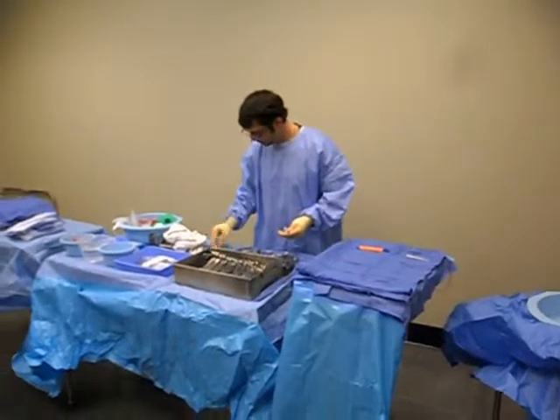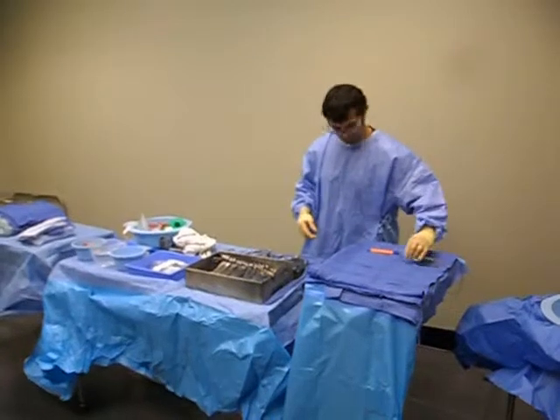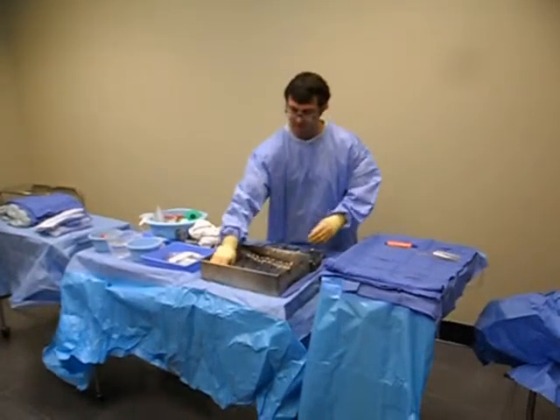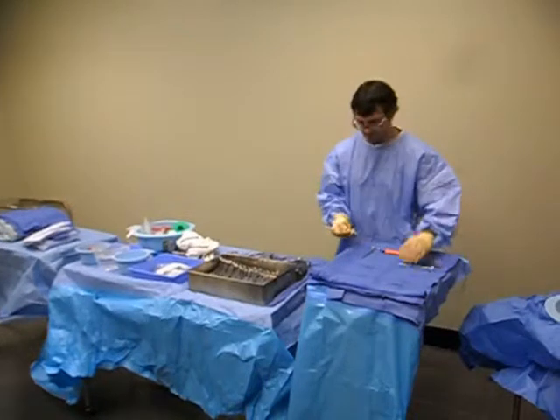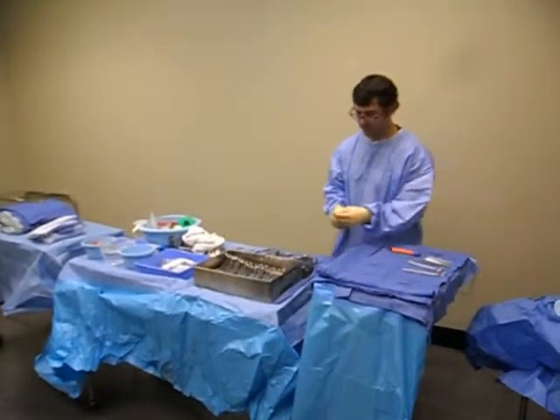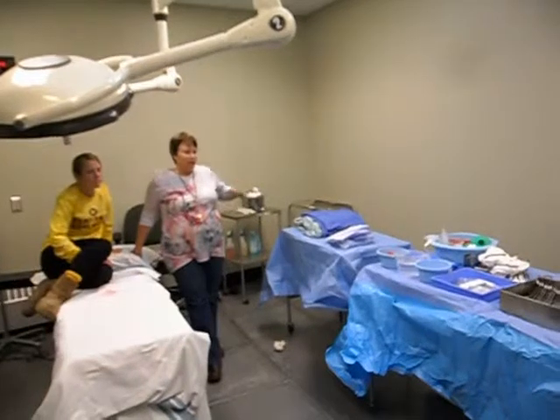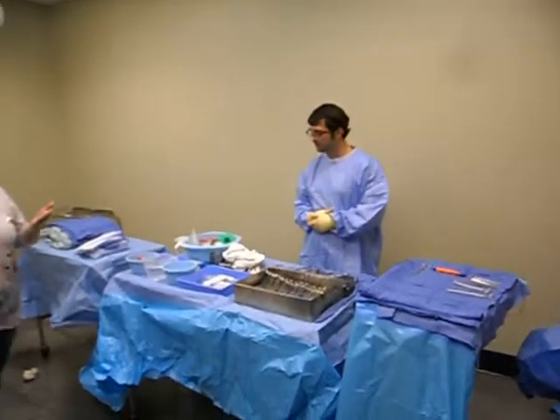Definitely gonna need some shorts and a long. I need that. Can I do my Babcocks? Thinking of the instruments that I need. Need that? Probably not. Okay, it's like what do you need that you don't have, as to where you're at right now, before you finish anything that you're setting up. What are you missing?